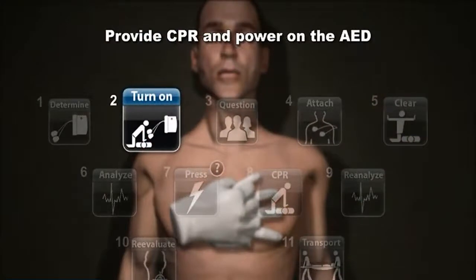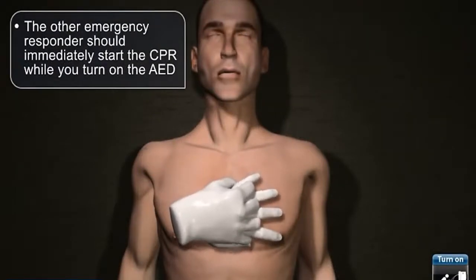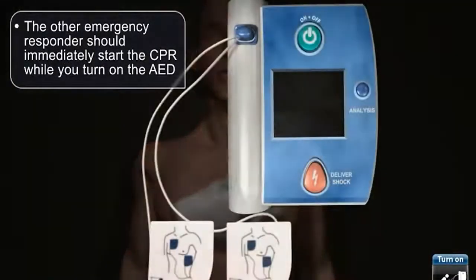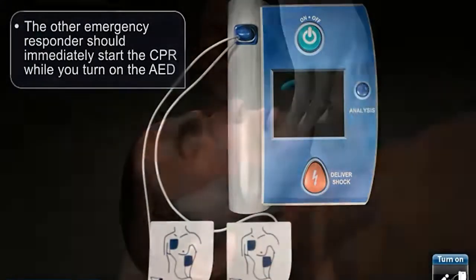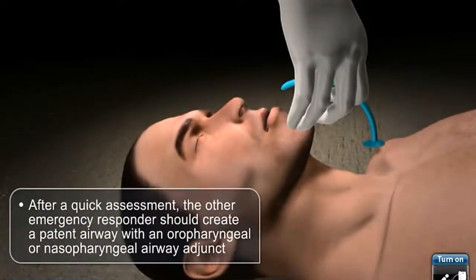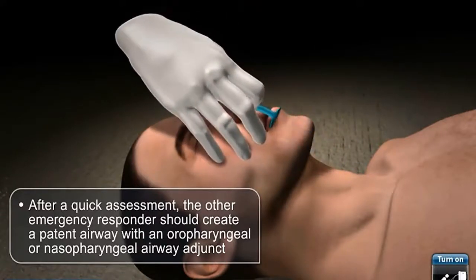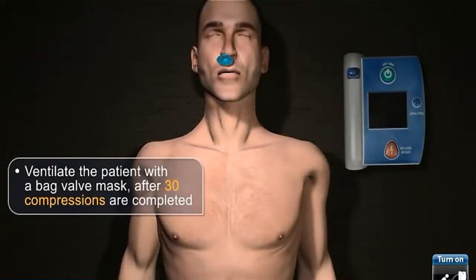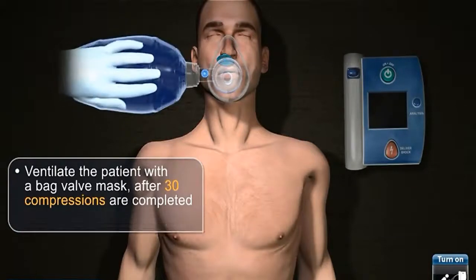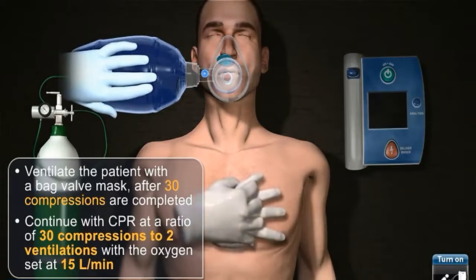Provide CPR and power on the AED. The other emergency responder should immediately start the CPR while you turn on the AED. After a quick assessment, the other emergency responder should create a patent airway with an oropharyngeal or nasopharyngeal airway adjunct, and ventilate the patient with a bag valve mask. Continue with CPR at a ratio of 30 compressions to 2 ventilations with the oxygen set at 15 liters per minute.